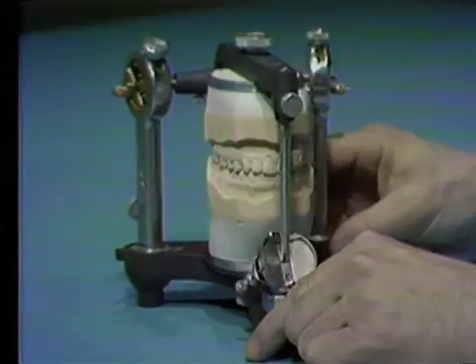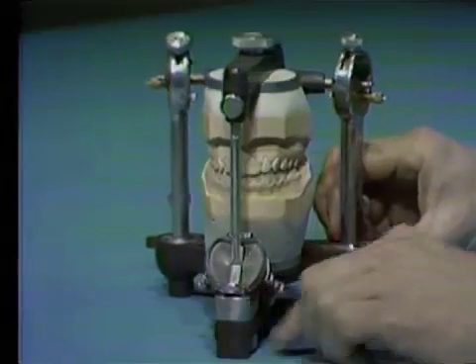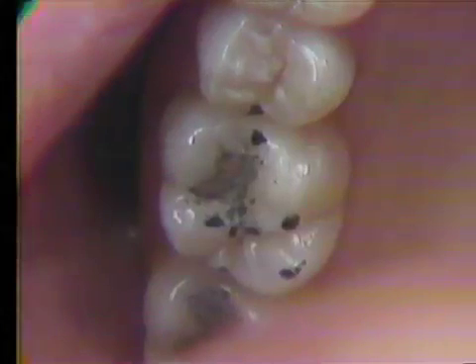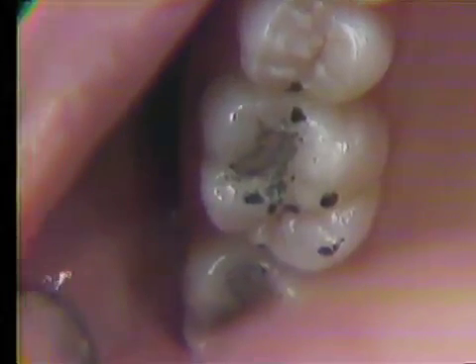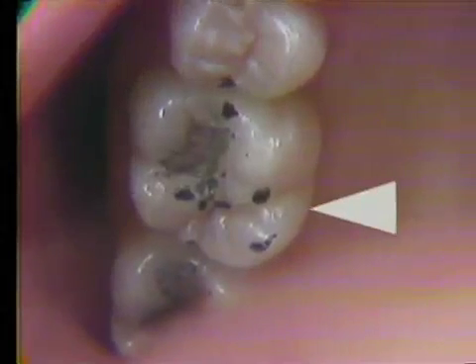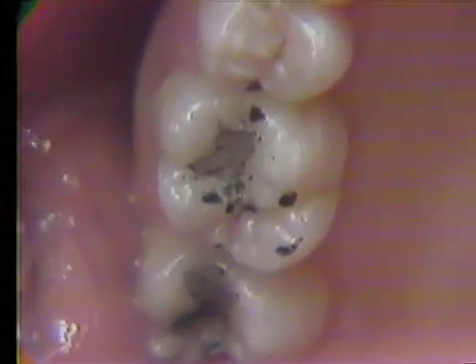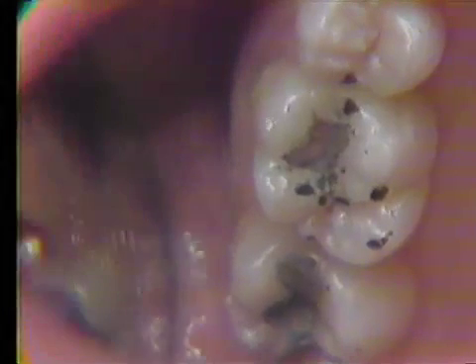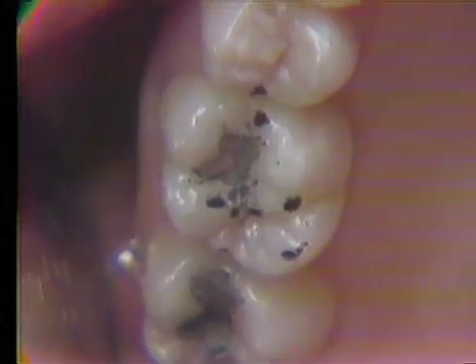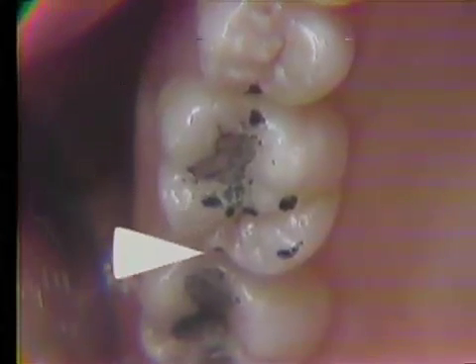A diagnostic waxing will be done on the maxillary right first molar, cuspid, and central incisor. Articulating paper is used to mark the contacting areas. The markings on the lingual cusps of the maxillary first molar are the supporting cusp contacts that occlude with the centric stops of the mandibular teeth. The supporting cusps of the mandibular teeth occlude on the mesial marginal ridge, the oblique ridge, and the distal marginal ridge.